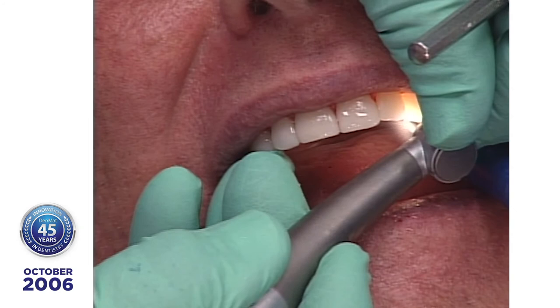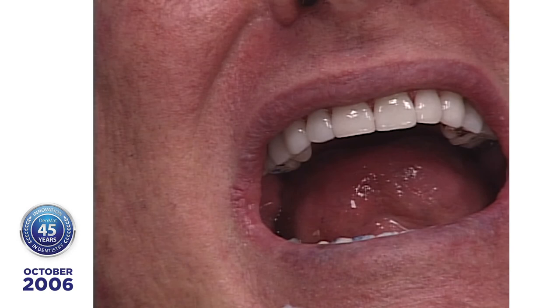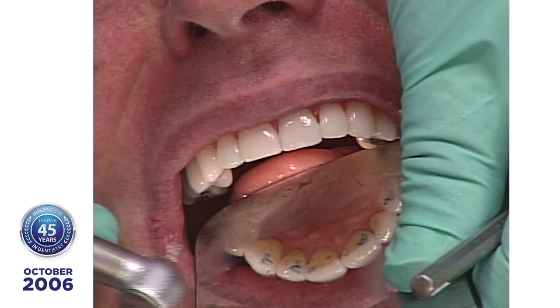Let's see what we got here. Gently close your teeth and grind around. We've got kind of a heavy spot there. I want to show that to everybody because this is where you're going to run into your problems. In this case, it's the mesial of that lateral. See that? Mesial of that lateral hitting that porcelain. So we want to give relief in there.